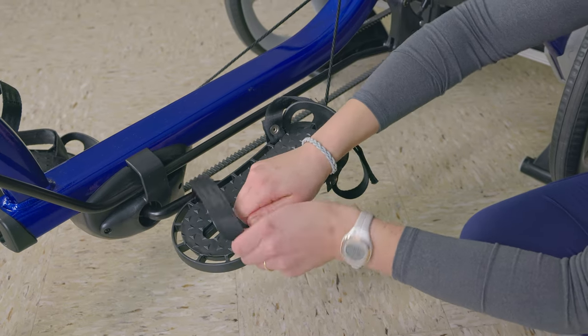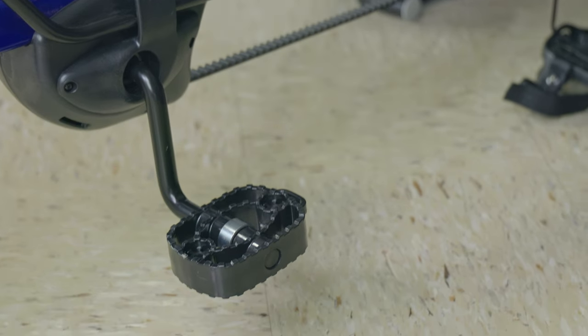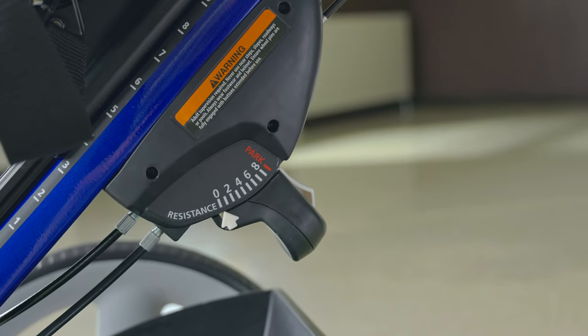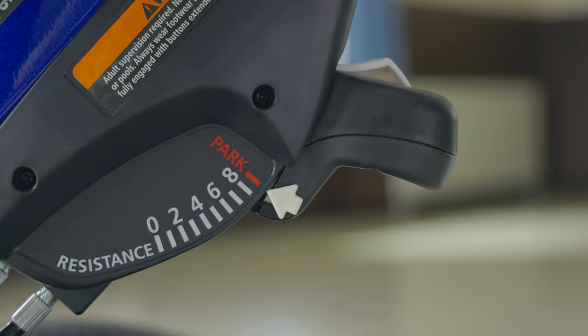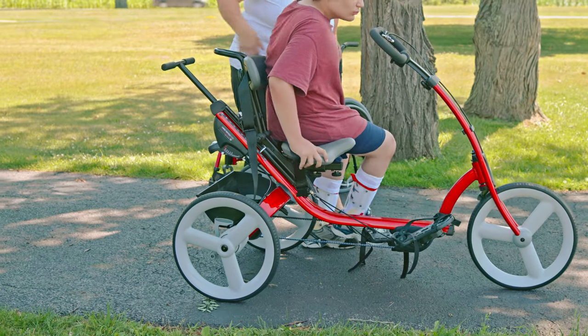The straps can be attached anywhere around the edge of the sandal. For a less involved user, we can remove the sandals to reveal a standard bike pedal underneath. The brake has nine different positions to set resistance for strength training or just to slow down riders a little bit. In the top position, it's the parking brake — be sure to set it whenever getting on or off the tricycle.